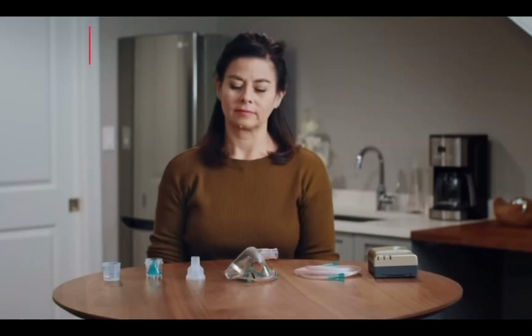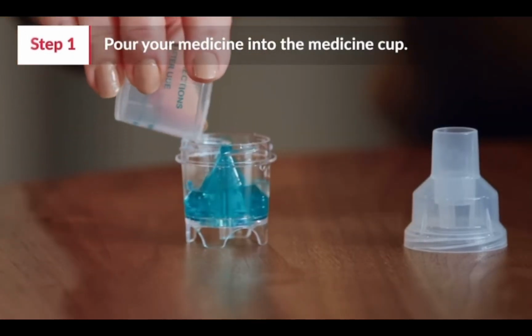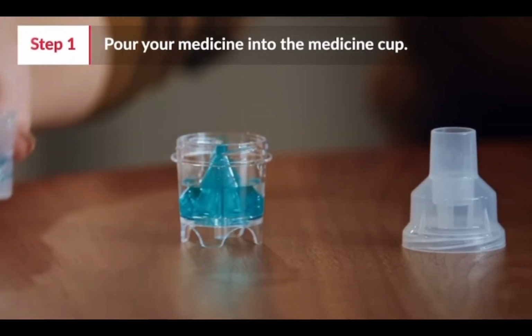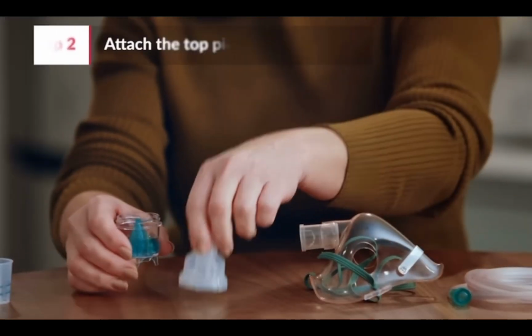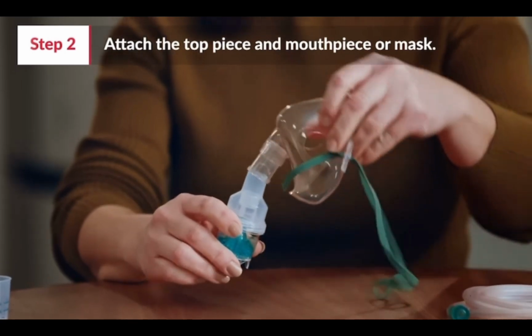We will be inserting a short clip on how to properly use a nebulizer and a glucometer set. With clean hands, take the medicine as prescribed by your healthcare provider and pour it into the medicine cup. Attach the top piece to the medicine cup and then the mouthpiece or mask.